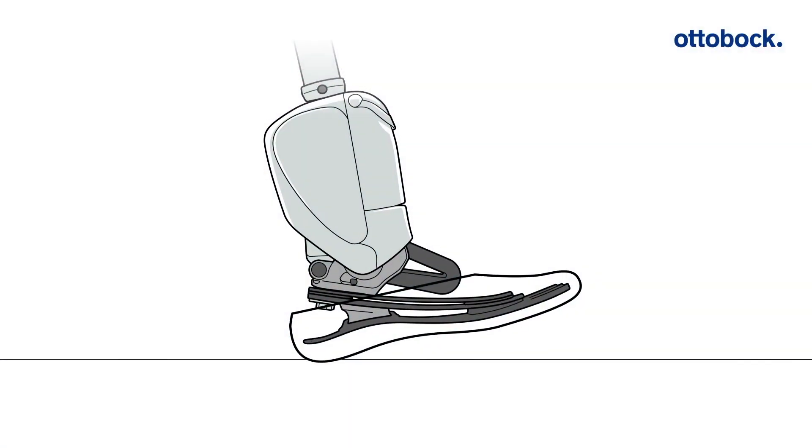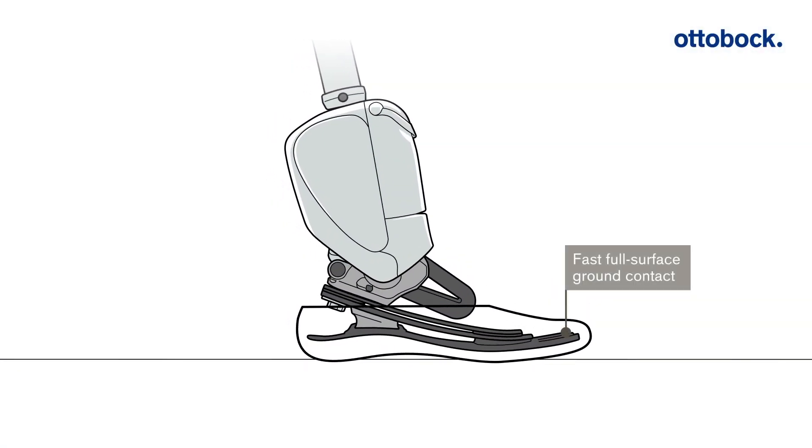When sitting, the Empower lowers the foot towards the floor. This not only looks more natural, but also provides relief for the user's residual limb.